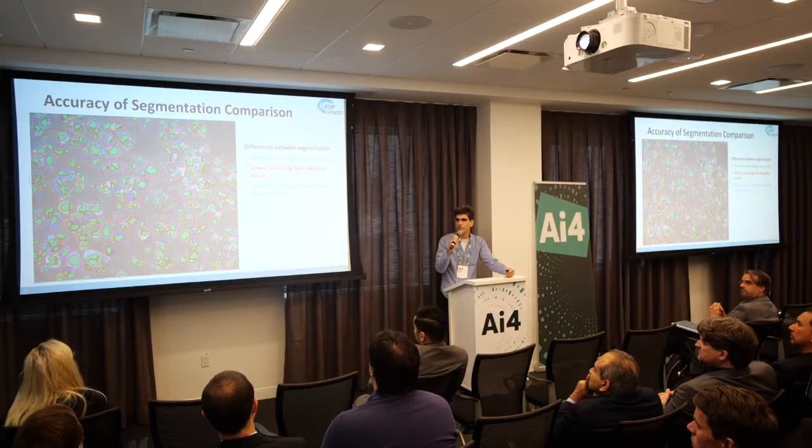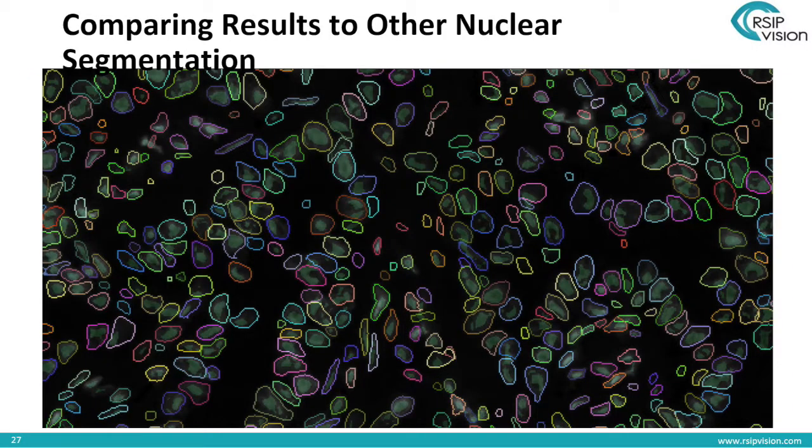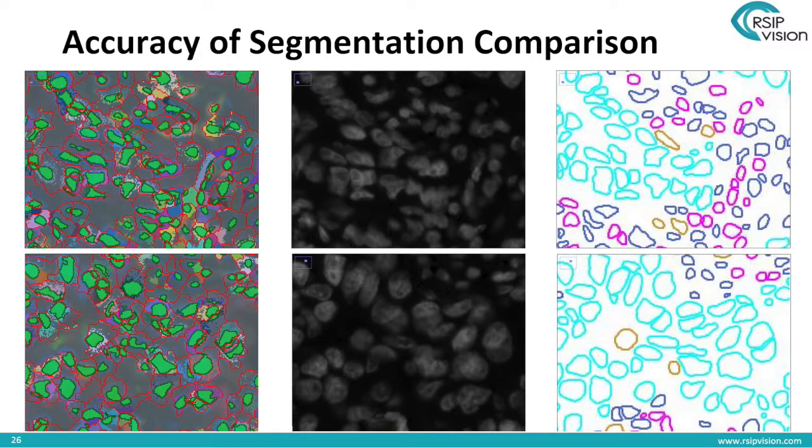These are more comparisons, basically the same idea. So again, a rule-based system is not going to get the overlap and the touching cells right. It's going to be very difficult to define the correct thresholds, and by feeding data into deep learning, this is really the way to go.